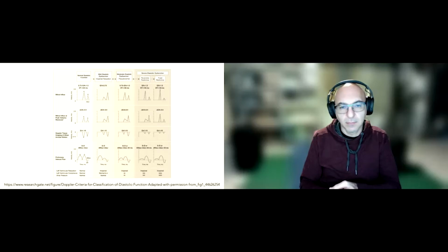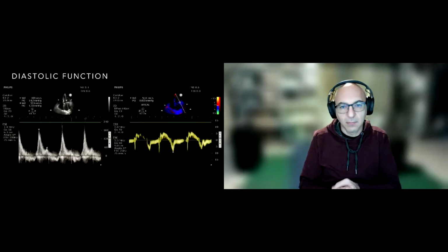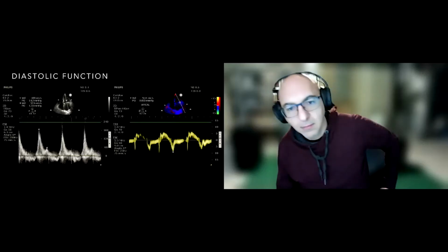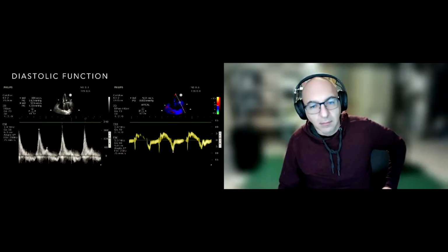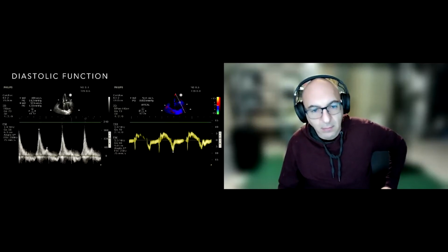So with that, I'm going to go back to this slide. Z, do you have any comments about diastolic dysfunction that you want to add in? Or maybe how does this information then color the patient's presentation with the dyspnea and fatigue that we're now seeing?